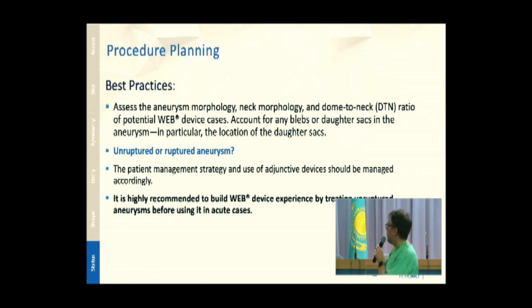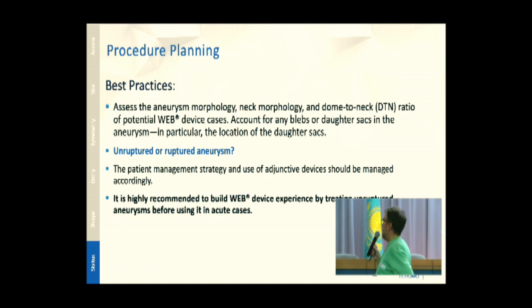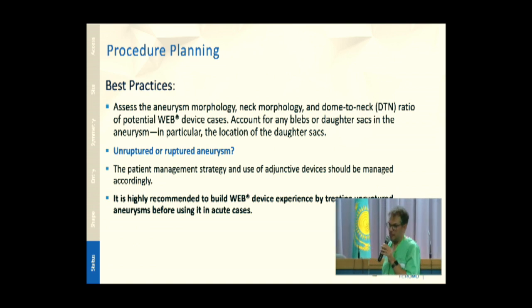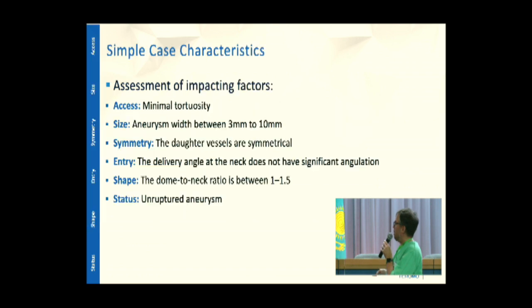Ruptured or unruptured: we recommend usually to get some experience with unruptured cases before you do your first ruptured case. The web is a very good device for ruptured aneurysms because of the antiplatelet regime. But to build experience, unruptured cases are recommended.